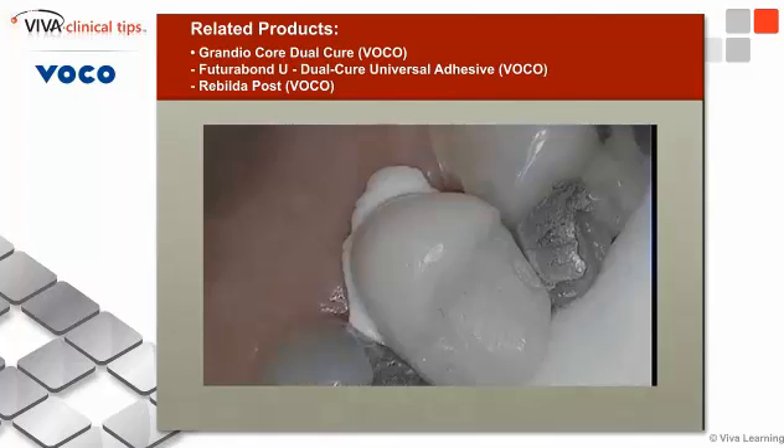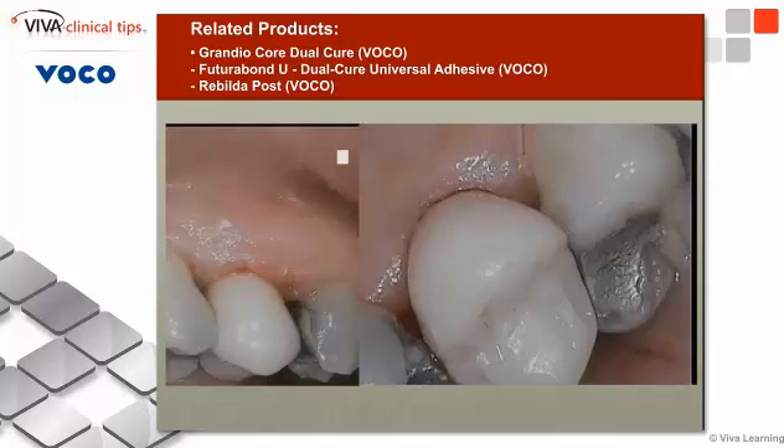I then clean the inside of the tooth with alcohol. In this case I might use some Ivoclean if necessary, but I've kind of switched to Ceramere, which is a cement that does not require preparation for zirconia crowns. I then place the crown back in, make sure the occlusion is correct, and there we have the reverse post-and-core done on this tooth — and it's been functioning fine and dandy since.